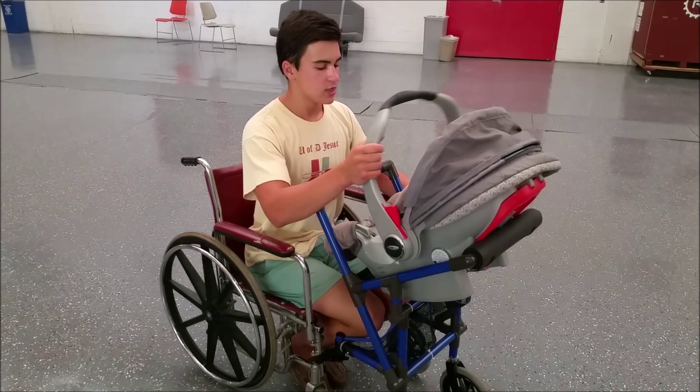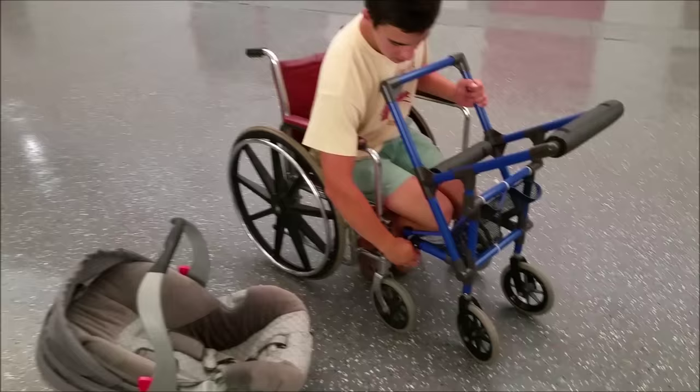I'm doing the wheelchair from the stroller. You would take the carriage out and put it safely on the ground.